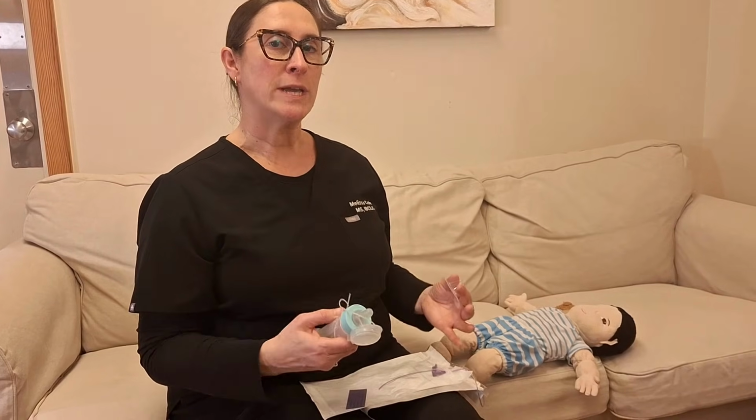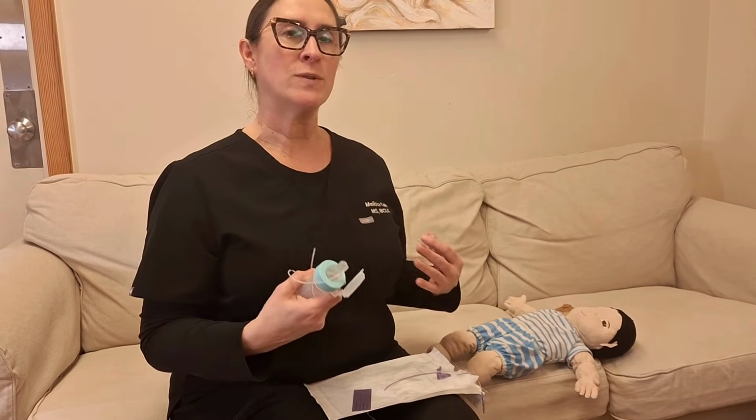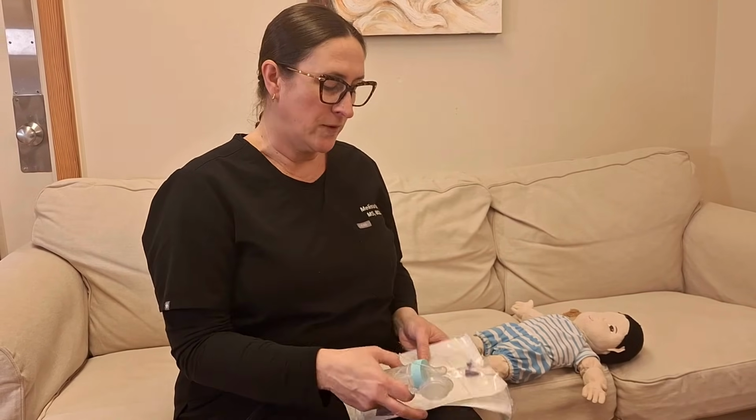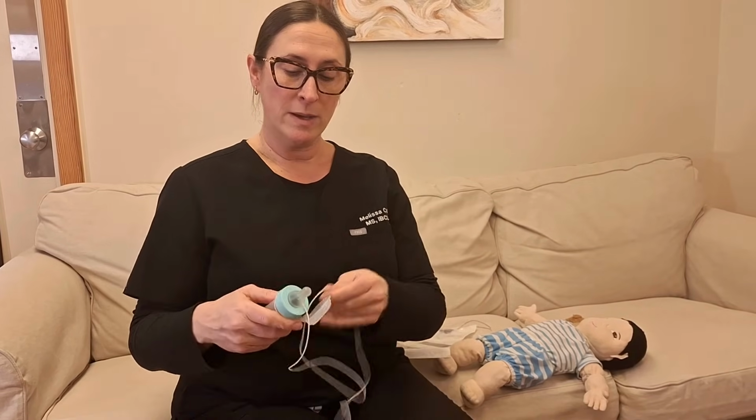I want to show you a few variations and just ways to troubleshoot the tube. So for some babies who need more support in drinking more rapidly, or they're slower having prolonged feedings, this is really gravity fed, so it can be placed higher while the baby's eating if they're a slow feeder and we need them to speed up a little bit. Or if they're really chugging, clicking, dribbling, and it seems to be flowing too quickly, a parent can lower the tube device. So by raising it up or lowering it, you can speed up the flow or slow it down.